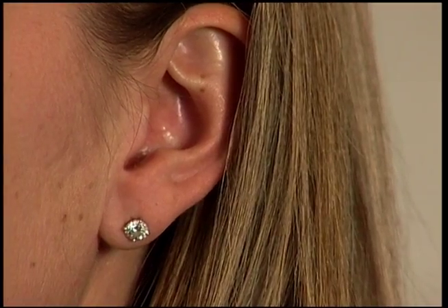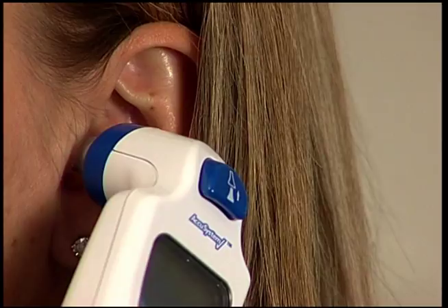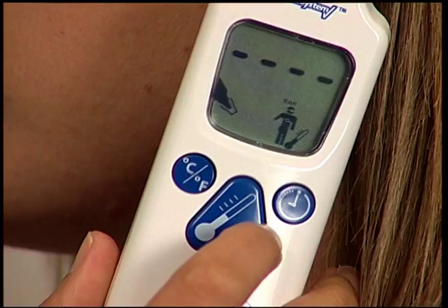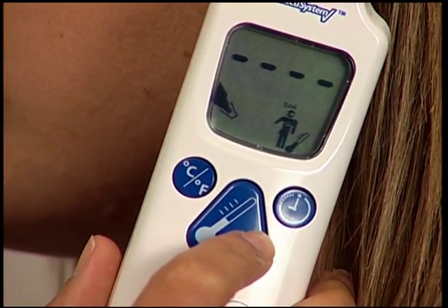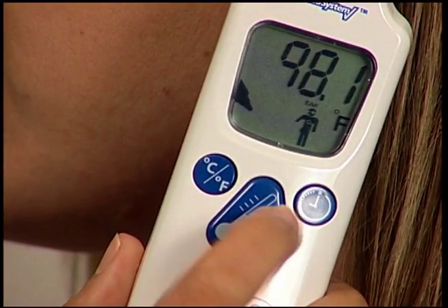Next, insert the tapered probe tip as far as it will comfortably fit into the patient's ear, aligning the probe with the patient's ear canal. Once you have a good seal between the probe tip and the ear canal, press the large triangular scan button located in the center of the handle and a temperature will be taken. It takes approximately two seconds for the Genius 2 to display an accurate reading. When the reading is complete, the Genius 2 will beep three times and the temperature will appear.